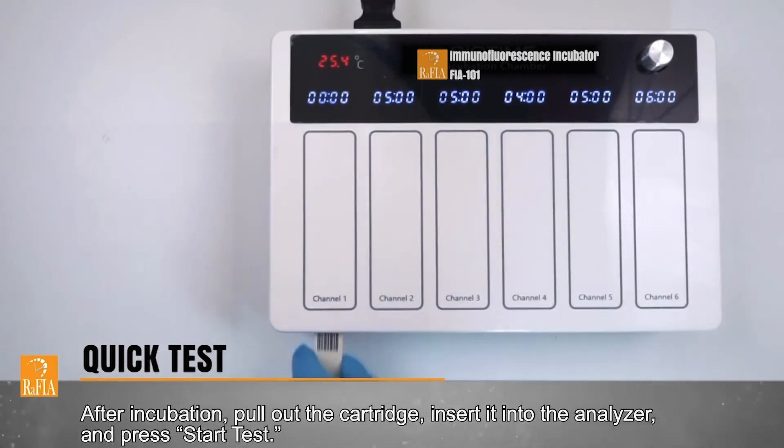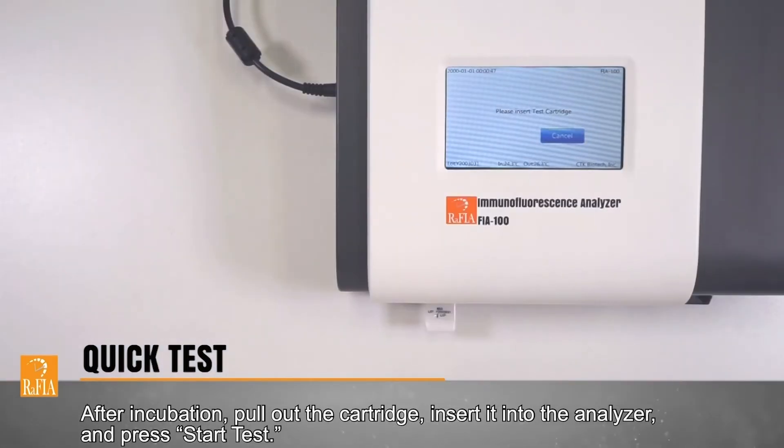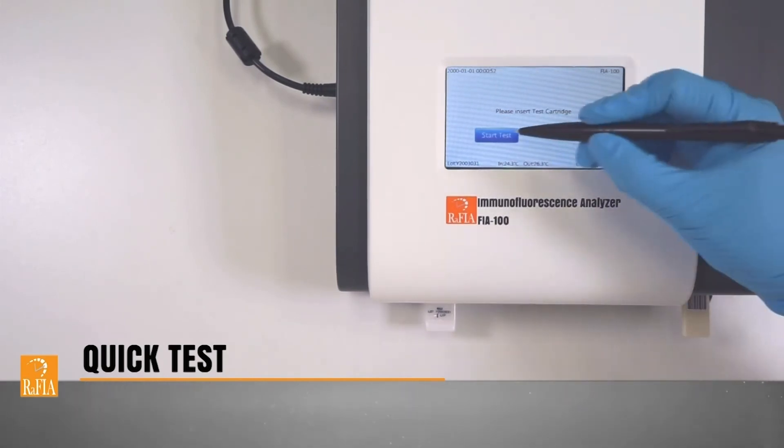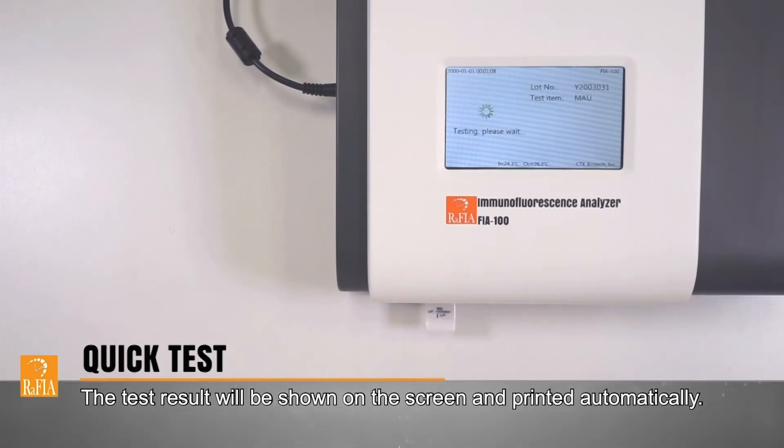After incubation, pull out the cartridge, insert it into the analyzer, and press Start Test. The test result will be shown on the screen and printed automatically.